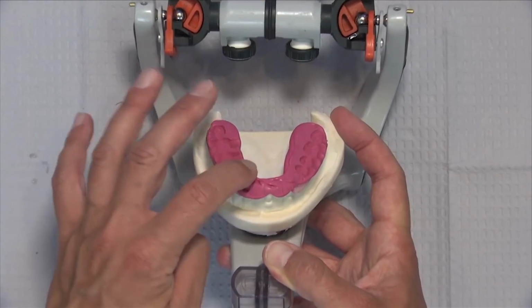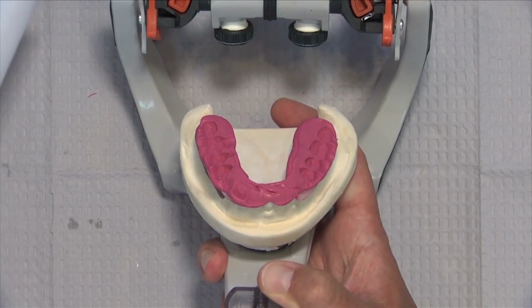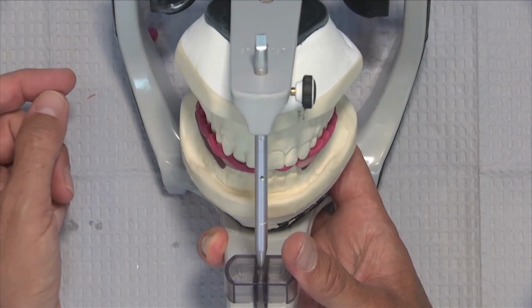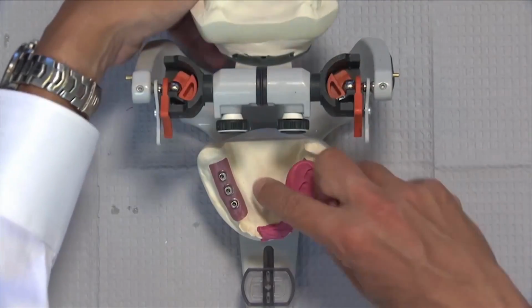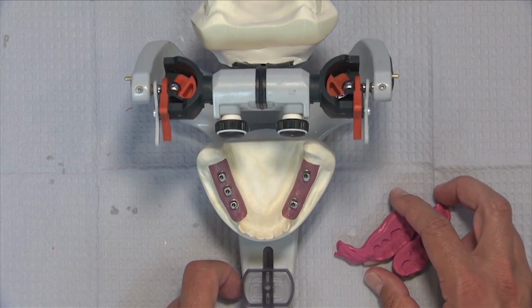This is as good as a bite registration is going to get, and I'd like to be able to duplicate this for removable as well as implant dentistry. And now when the patient closes back into this, they close right down into it, and we're able to verify this. And so at this point, all we have to do is remove the segments, and we're going to remove the custom abutments and send this all back to the laboratory.